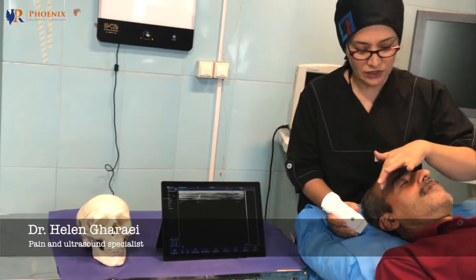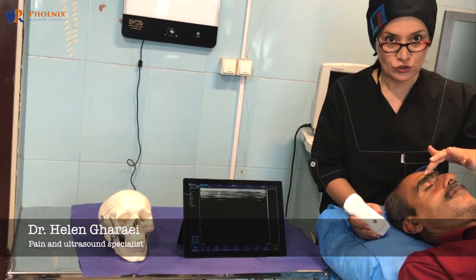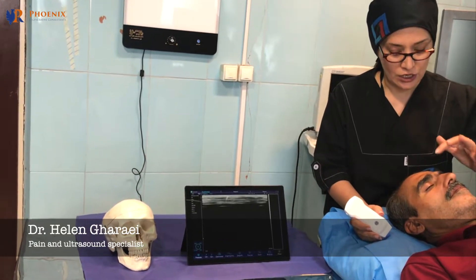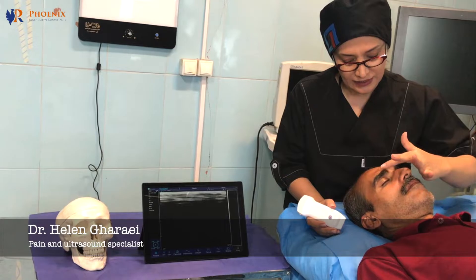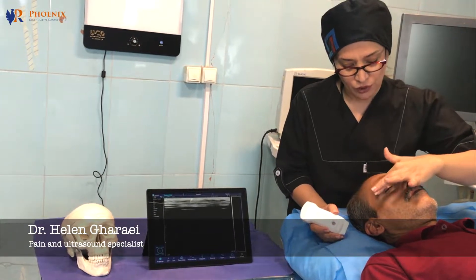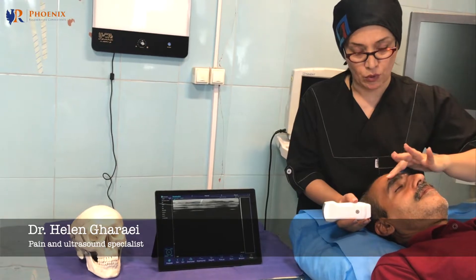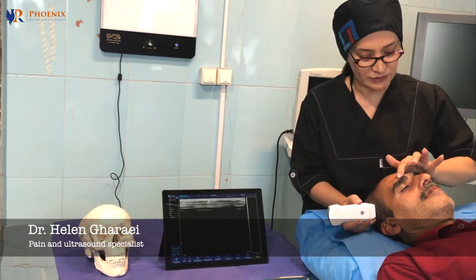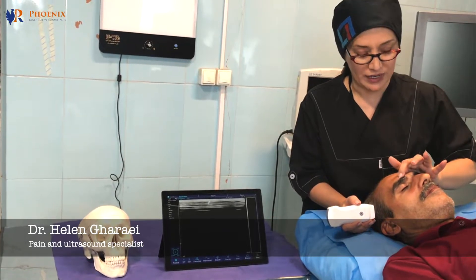You have to know that the surface anatomy of the supraorbital foramen is here. The important point is that the rim of the orbit is here, above the eye. You have to put your probe up to the bone. You can touch the foramen here, about two centimeters near the midline. This is the supraorbital foramen.